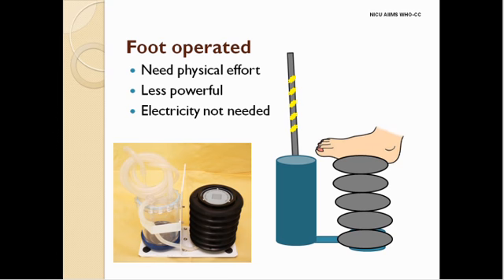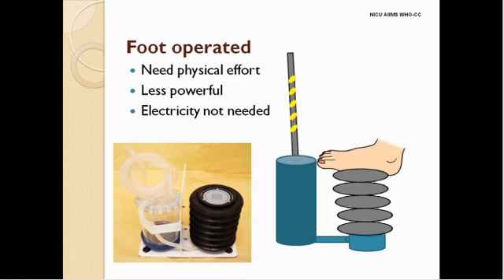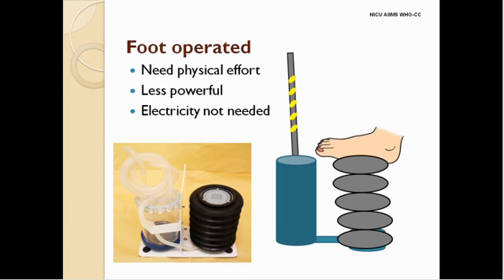The foot suction machine works on the principle that when the bellows are compressed, the air is forced out in the upper part of the bellows. And as the bellows re-expand, a vacuum is created, and this vacuum transfers the secretion from the patient to the beaker, as shown in the figure. The most effective result is obtained by the regular rhythmic compression of the bellows.